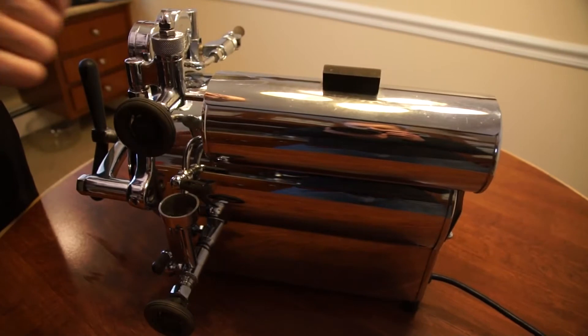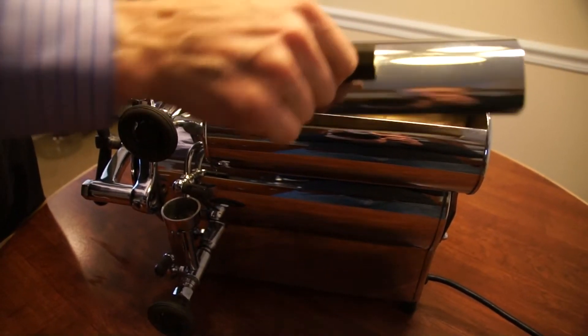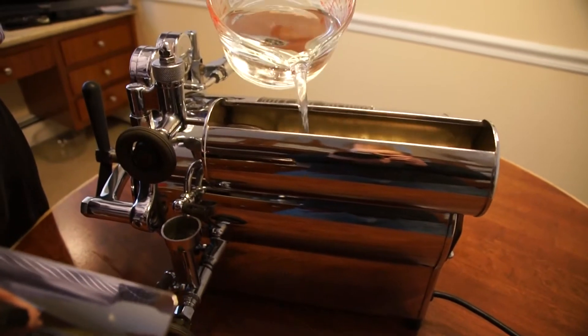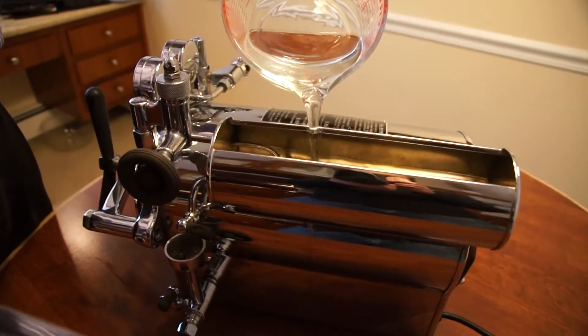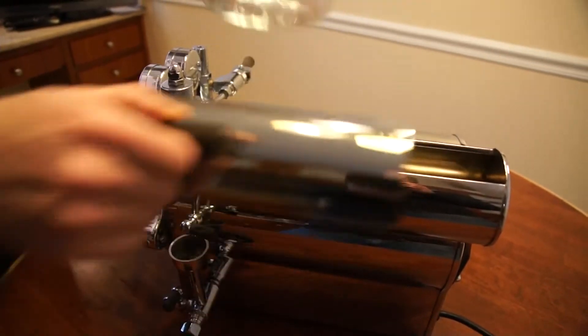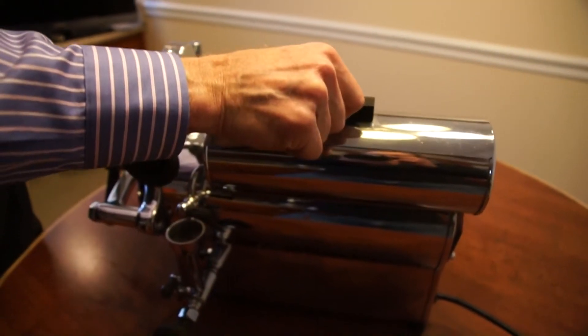First we're going to take our distilled water — we have about three cups — and we're going to put this into the reservoir. Pour it into the reservoir, and this water will go from the reservoir into the inner chamber.